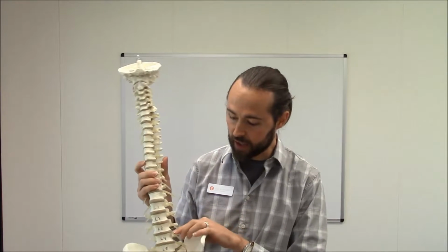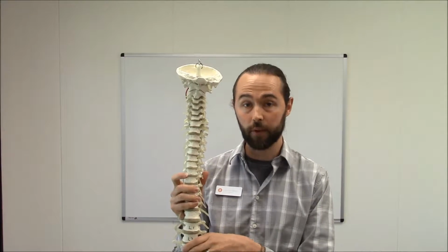So that's a good place to start on a lot of that imaging, whether it's X-ray or MRI, just knowing, okay, what even is L3, L4? The L3, L4 disc. Or the facet joints at L3 or L4 are where the facet on top of L3 runs into contact with the facet on L4. So that's your arthritic changes. If you took that same idea, you could apply it to your neck as well. Up there, it'll be your cervical spine, so that'll be C1, C2, all the way down through C7. So there you go. Those are your arthritic changes, again for your gobbledygook.